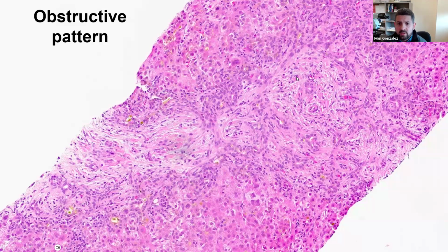So for us in pediatric pathology, it's very important to denote the difference between a bile duct and a ductule. A bile duct should be entirely embedded within the portal tract, and it should be surrounded by stroma, by connective tissue. Whereas the ductule will be located in the limiting plate, not inside the portal tract, and not entirely surrounded by connective tissue. And the difference matters if you're working on a case, for instance, of bile duct paucity, and you're doing a ductal count, where you're actually counting bile ducts, not counting the ductules. So it's really important for us to get that difference.